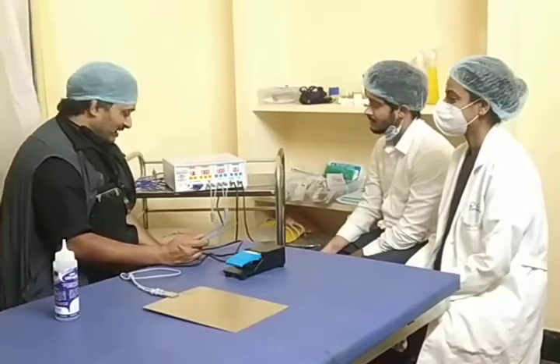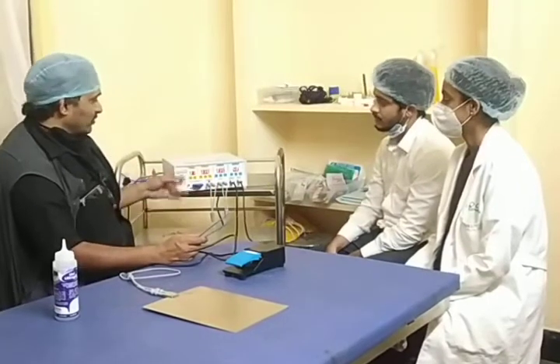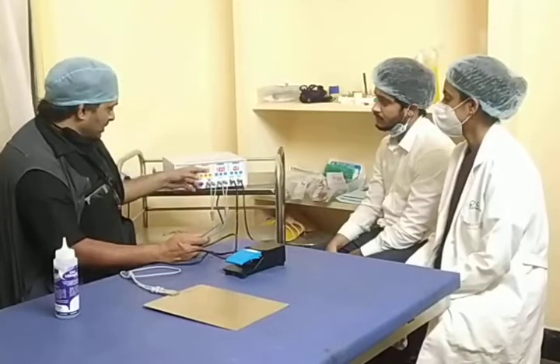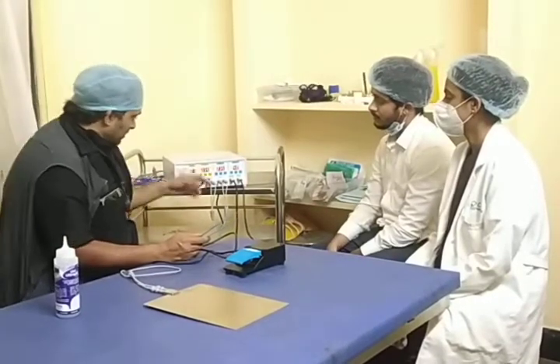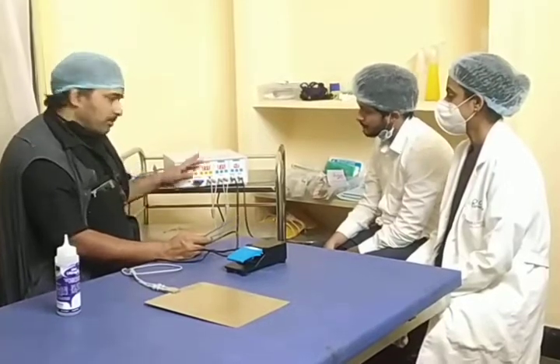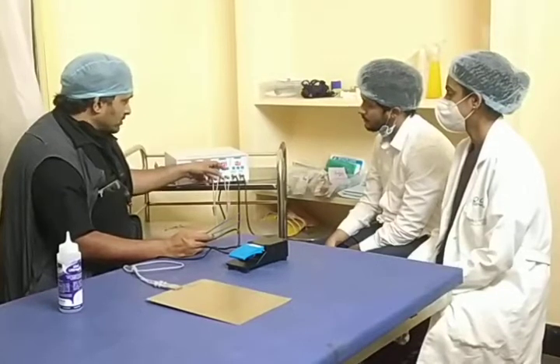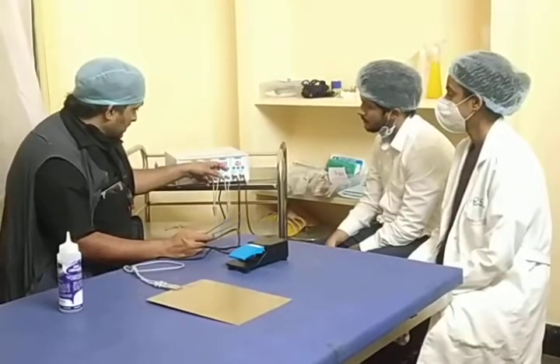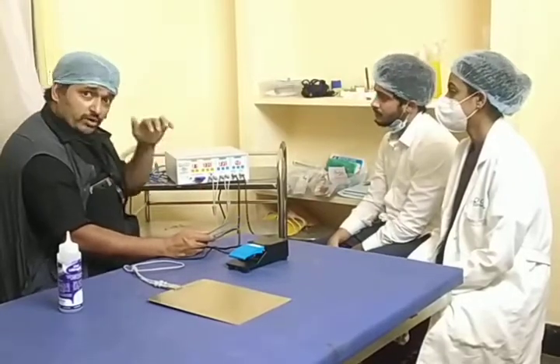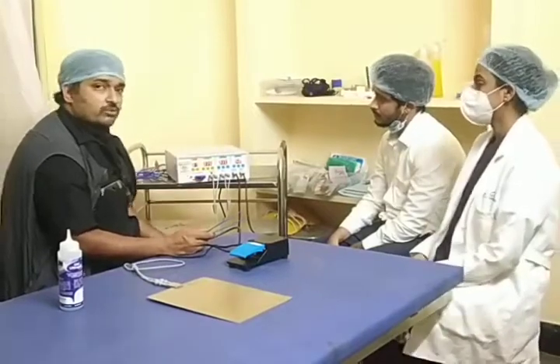So make sure this is lubricated, and depending upon the surgeon's preference, you have unipolar option, bipolar option, hand operated switch, foot operated switch, and then the settings are pure cut, blend 1, blend 2, and endocut. Usually blend 1, blend 2 or pure cut suits our purpose very well. For coagulation, there is a spray mode and there is a fulgurate mode. Spray mode is for superficial and fulgurate is for deeper, like bigger vessels or bigger areas. And it is again up to the preference of the surgeon.